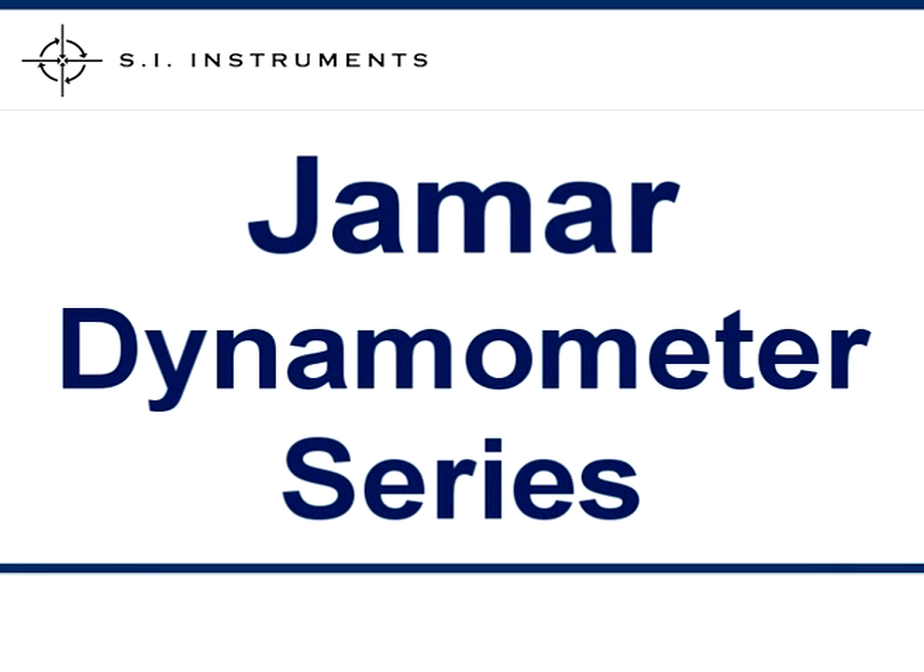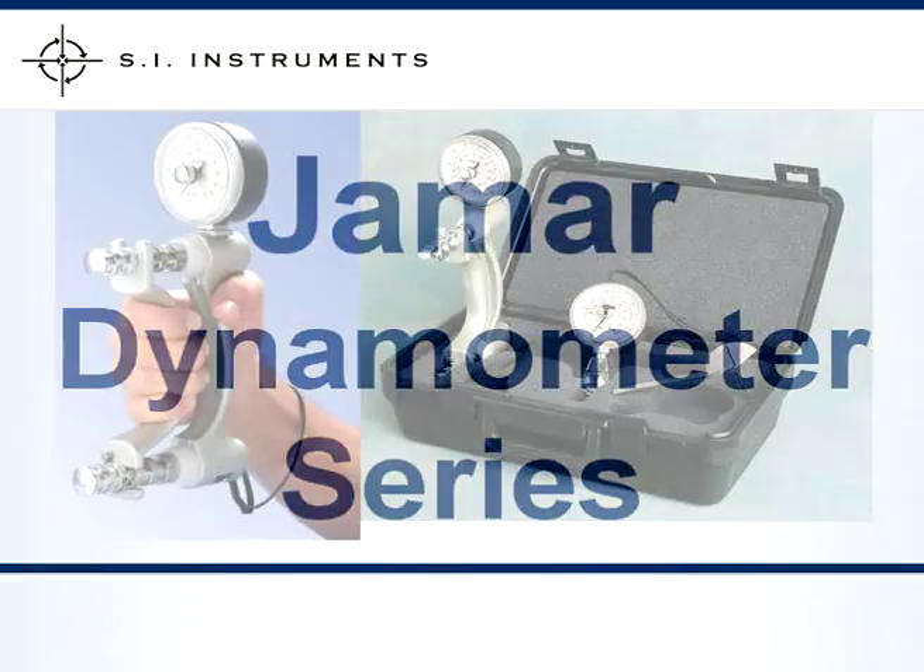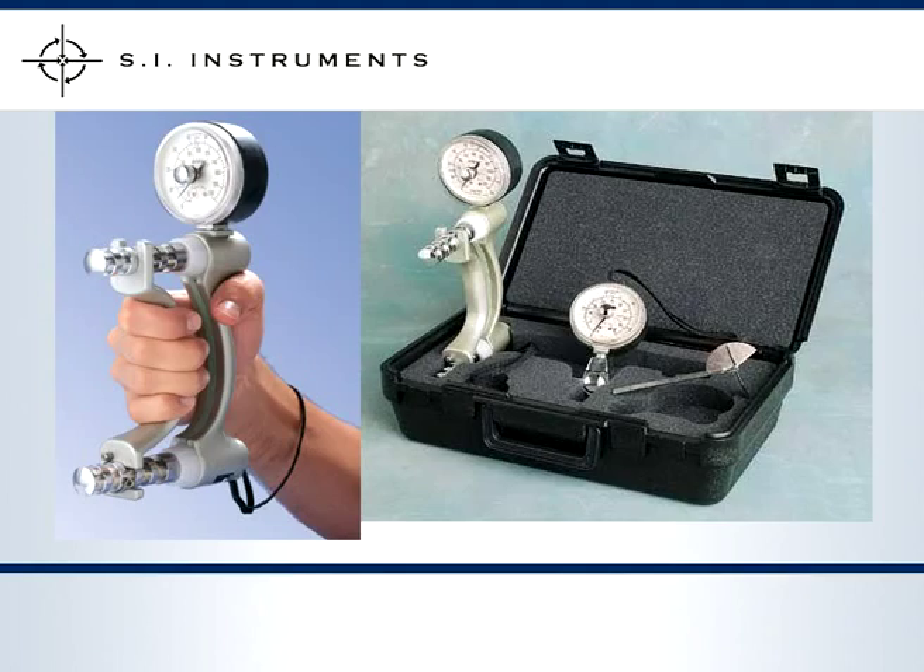The Jamar Dynamometer series consists of a variety of units aimed at providing easy to use and accurate dynamometers. These dynamometers provide reliable hand grip or pinch test results and are adjustable to deal with a variety of hand sizes.